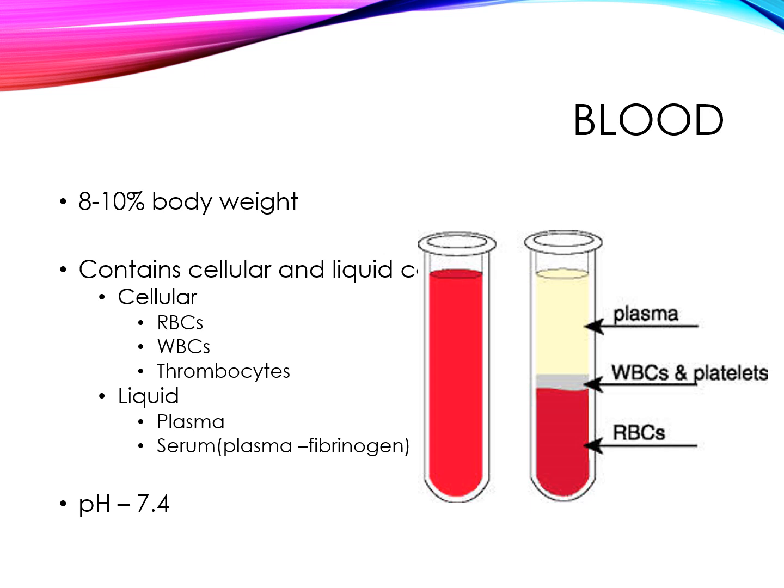And there's also a liquid component called plasma. And if you can see over here on the right, there is an example of whole blood that has either been spun down or is left to sit. And you can see that the way that it would separate is the red blood cells on the bottom, the white blood cells and platelets together in a thin band, and then the rest is the liquid portion or plasma.